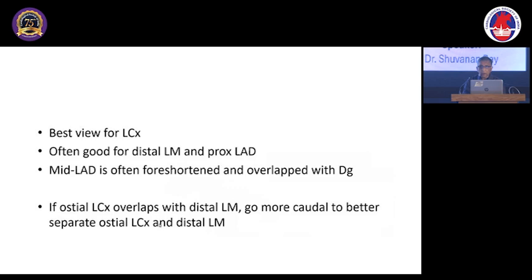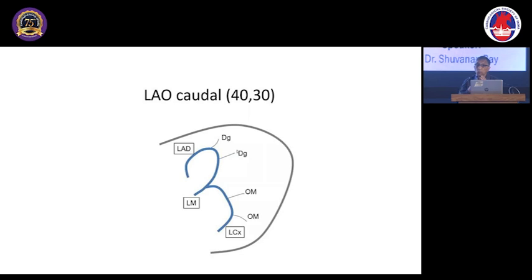First, I need to have a correlation with my clinical findings. Number two, I need to see whether something has to be done, what type of management the gentleman or lady should have, and whether I can do it safely, and lastly, what would be the long-term effects. So with that in mind, I will see a coronary angiogram. So there are some general ideas.